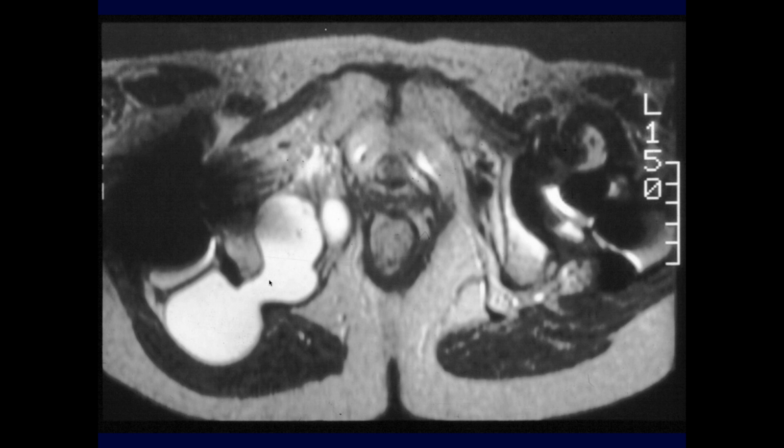Okay, so this is a large periarticular fluid collection in someone who has a total hip and has a lot of pain on that side. What are you concerned about? I guess could it be post-surgical? Could it be an abscess? It doesn't look like it. The margin's nice and thin here.